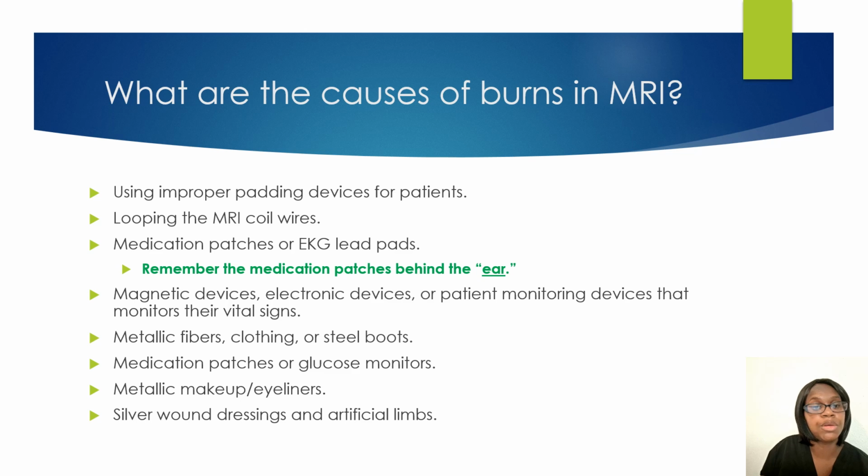I have the patient remove it because I don't have time to take a chance for the patient to get a burn or look it up to see if the patient can get a burn from it, especially whenever there are other appointments waiting, other patients on time. They want to have their scan done as well. So I do not want to take any chances on letting a patient go inside the MRI room with the medication patch on. So I have them remove everything that can come off.